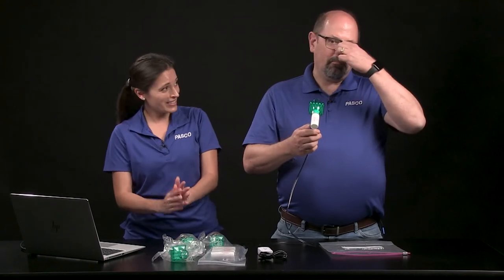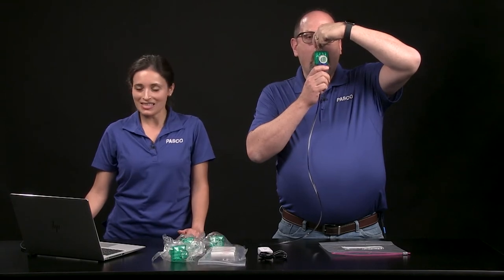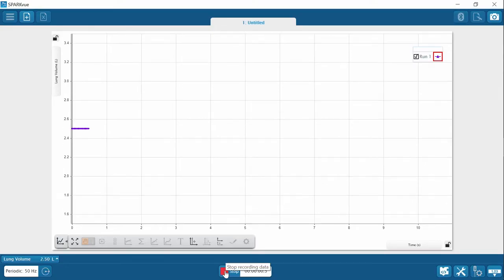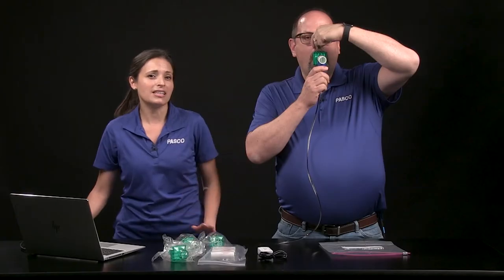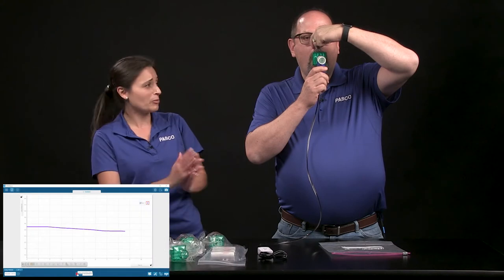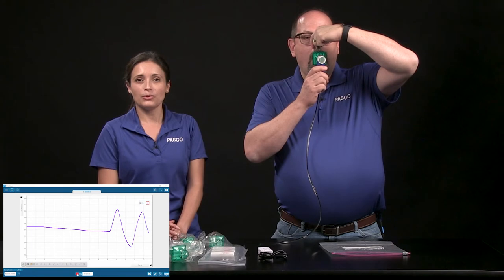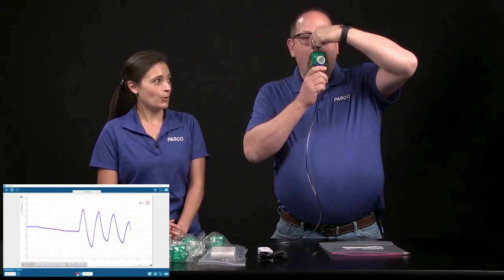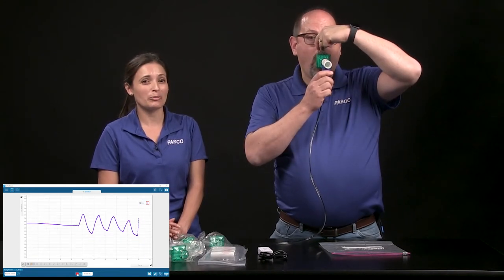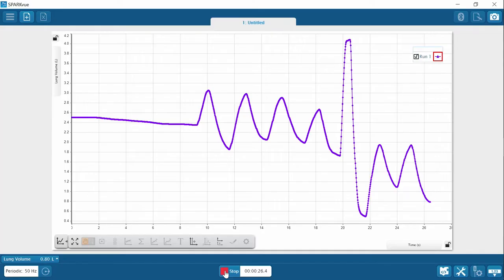Ready for the real test? Pinch your nose, hold your breath, position the filter, stay still. We have to wait for the Bluetooth connection light to finish flashing red and green and return to steady, showing the sensor is calibrated and ready. Now take four normal breaths — one, two, three, four — maximum inhale, maximum exhale, two normal breaths — one, two. And now data collection is stopped and we're done.